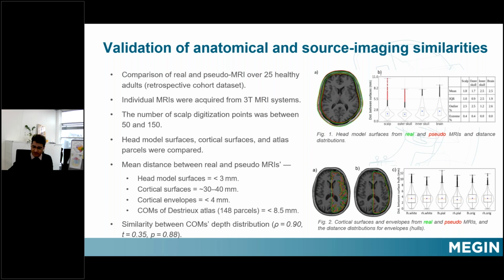Then there were a couple of extreme points, and the extreme points were basically like 3 times the third quartile. So anyway, this looks quite similar. The mean difference shows that they were quite close.